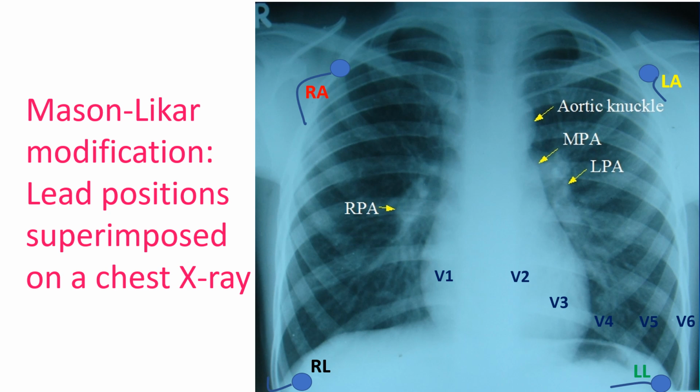The difference in pattern of the modified 12-lead ECG mandates caution while trying to interpret Q waves and other abnormalities on a Mason-Likar modification. This system is mainly meant for assessment of ST segment deviations and heart rhythm abnormalities during exercise test.